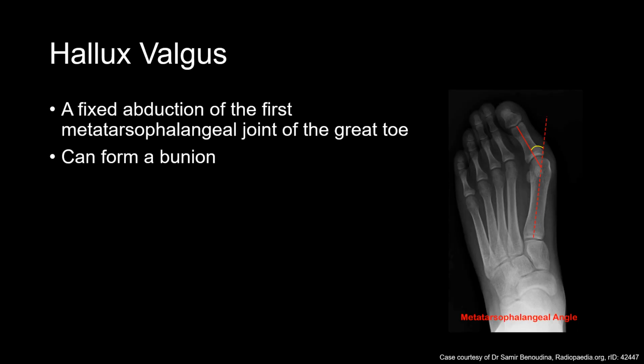Some congenital anomalies and normal variants. Hallux valgus of the first toe. So you have a valgus deformity here at the first digit of the foot, and you can see here how far off it goes based off of this angle measurement. And when you have this, it can lead to pain, poor foot biomechanics, and bunion formation. You can see the bunion is starting to form out here.